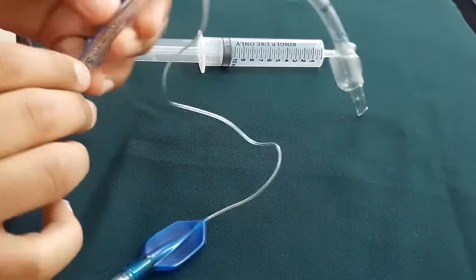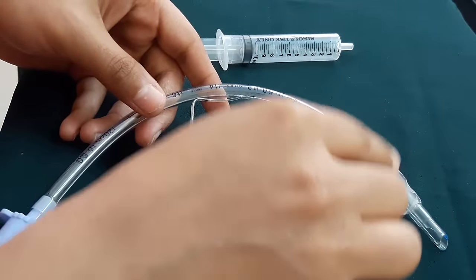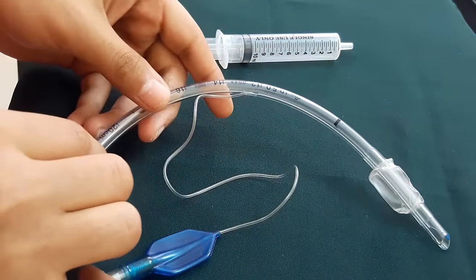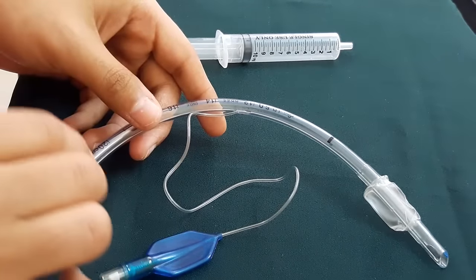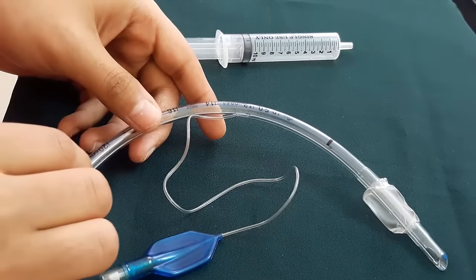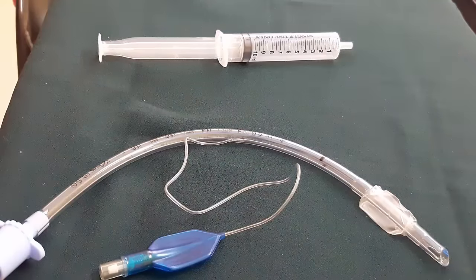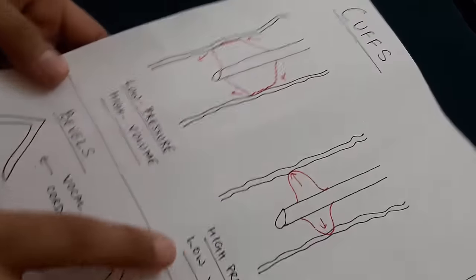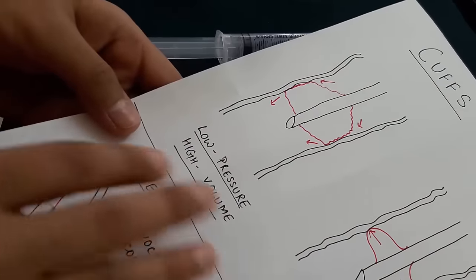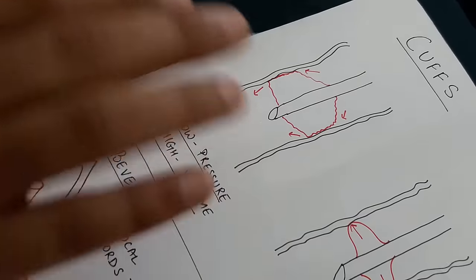The radio-opaque marker allows accurate positioning to be confirmed by X-ray. The third part is the cuff, in the case of a cuffed ET tube. The cuff provides a seal against the tracheal wall and prevents gases from leaking. It also allows positive pressure ventilation and prevents matter from entering into the trachea.